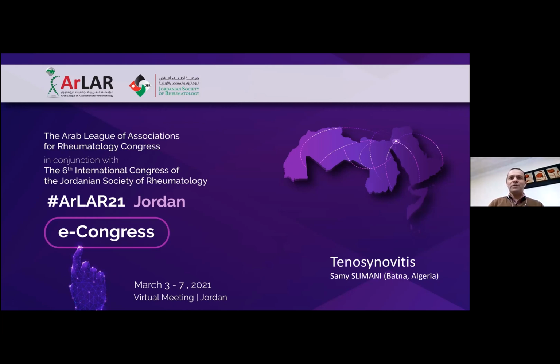I'm a rheumatologist from Batna, Eastern Algeria, and it's my pleasure to make a summary of the importance of tenosynovitis in rheumatic diseases, especially in ultrasound.